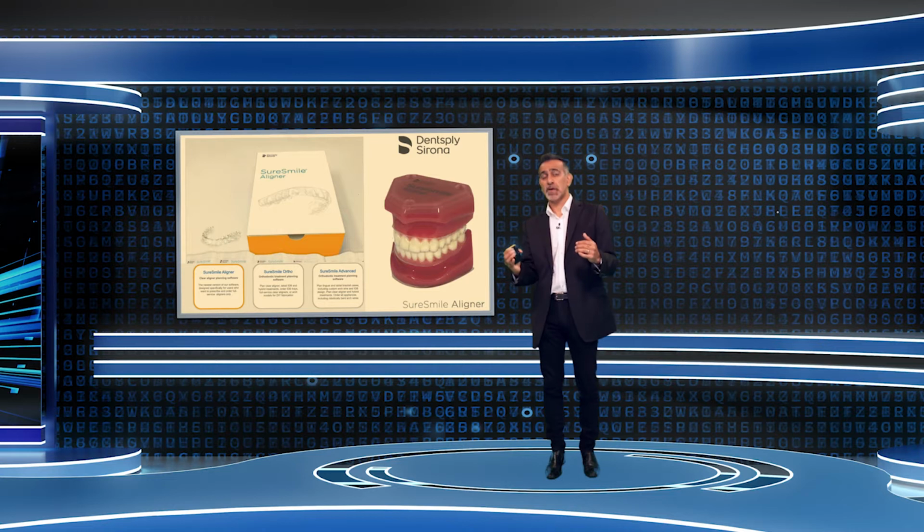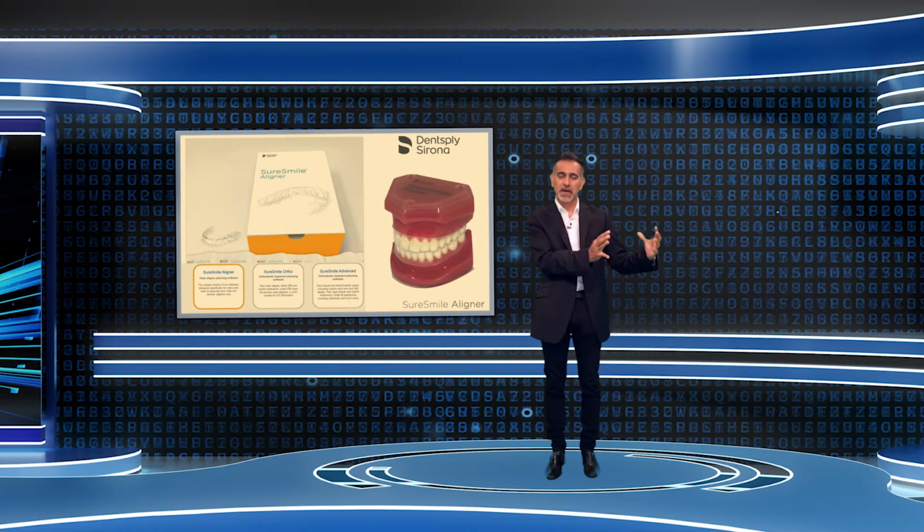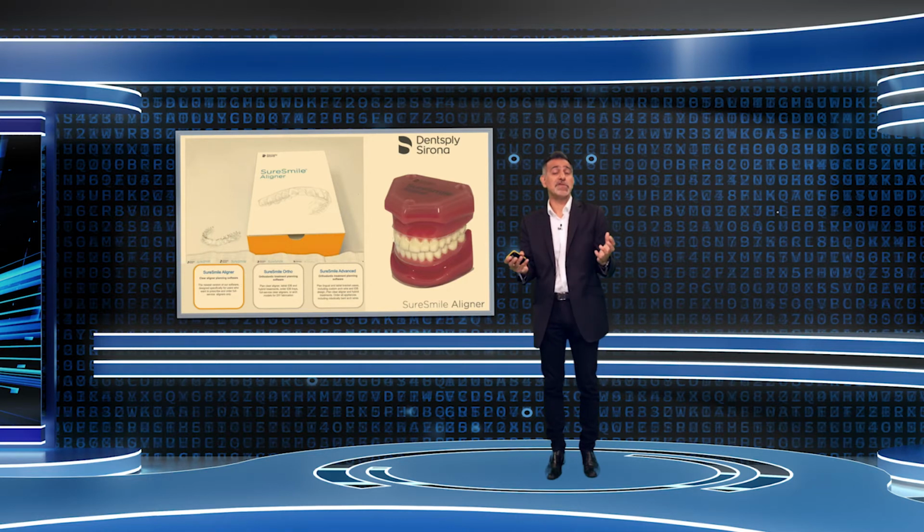SureSmile Ortho and SureSmile Advanced are also excellent systems. My recommendation for those is, that's really for much more advanced users or very experienced general dentists or orthodontists. But SureSmile Aligner, as mentioned, is really where the GDP entry point is. And that's what I use most of the time myself.